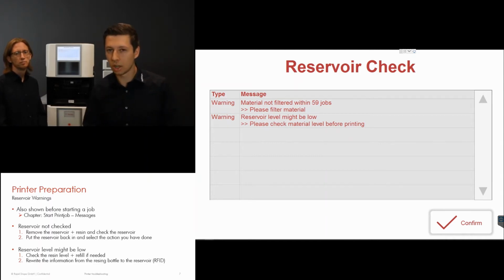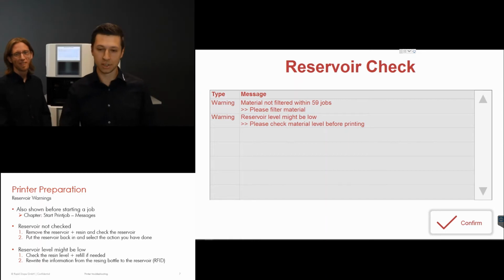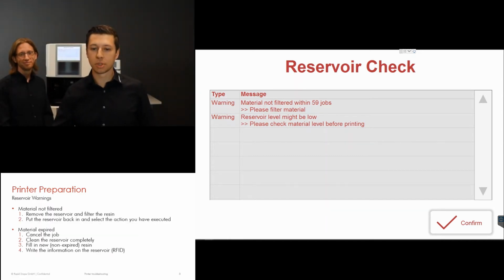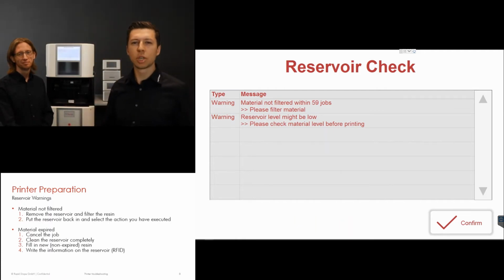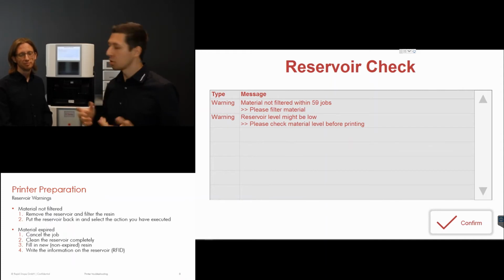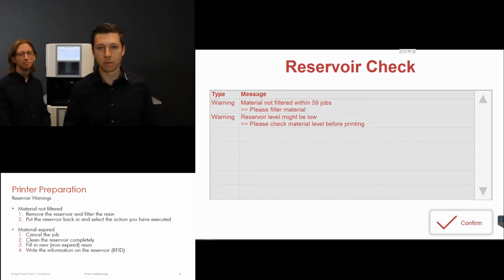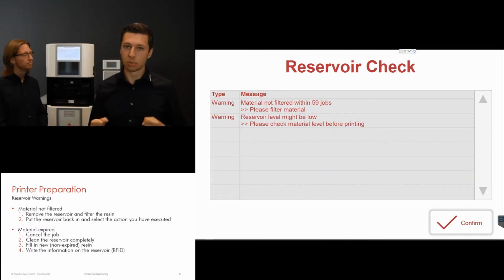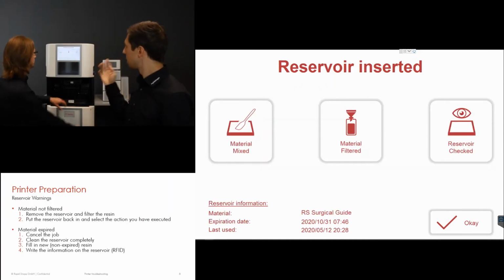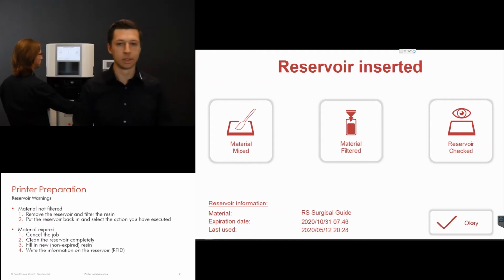We won't change it now as we got some other error on here which we want to show you. So this one we solve later on. But the next one which we can solve now is the material was not filtered. Most of the time you can combine this, as I already told you, when you're checking the reservoir, because you have to remove the resin out of the reservoir, so just filter it as well. The extra step you then have to take once you filtered it, put it also one time out and back in again, confirm the messages and say, I have filtered my material.